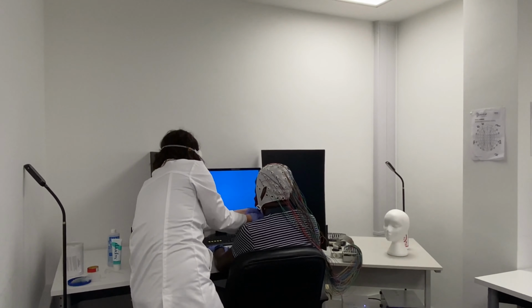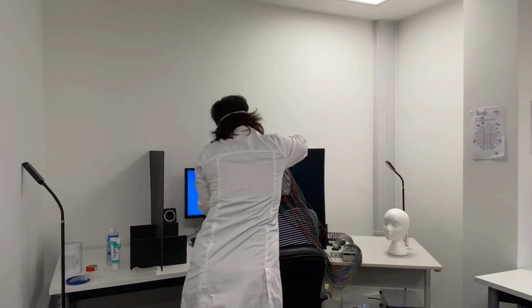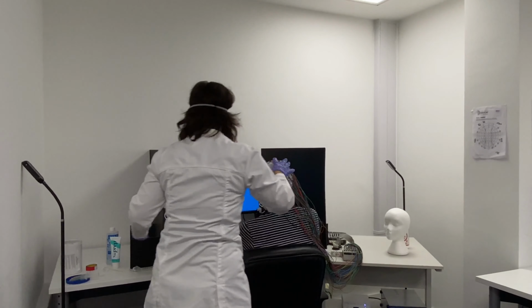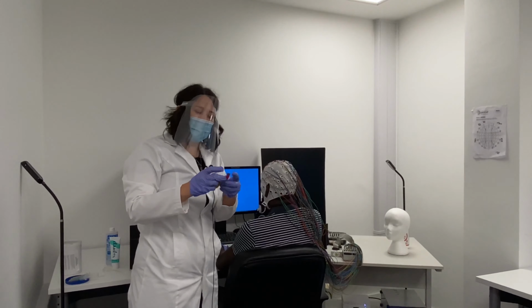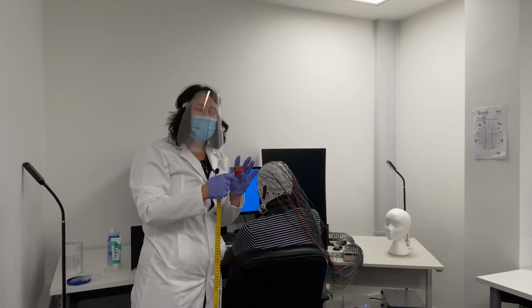Thank you. Each head is a little bit different, so we need to position the cap as accurately as possible.